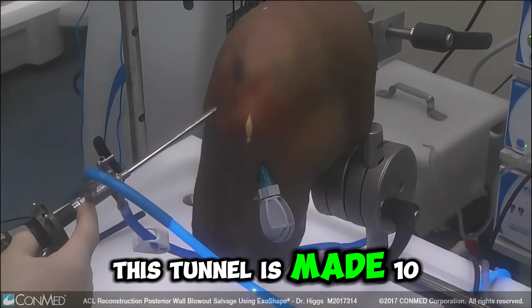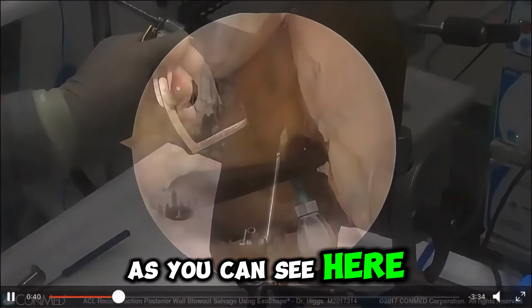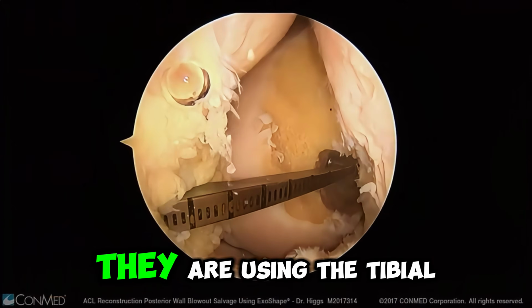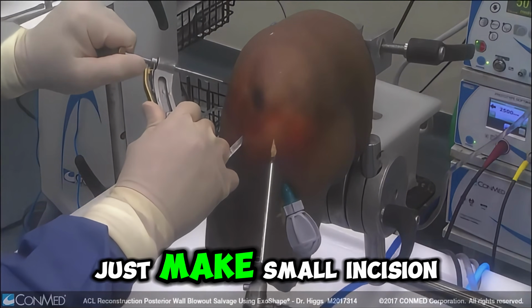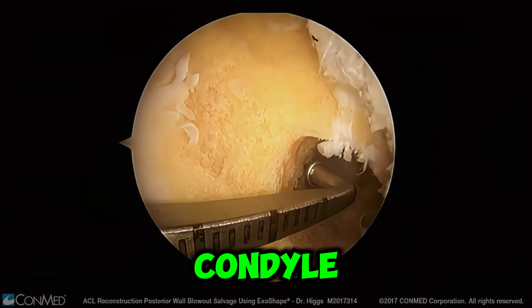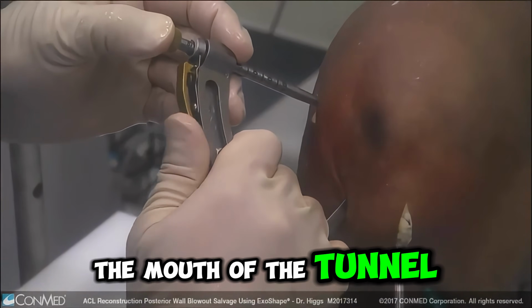And this tunnel is made 10 mm posterior to the previous one, as you can see here, using the tibial guide. They make a small incision anterolaterally over the lateral femoral condyle, and then the tunnel is made just 10 mm posterior to the mouth of the tunnel.